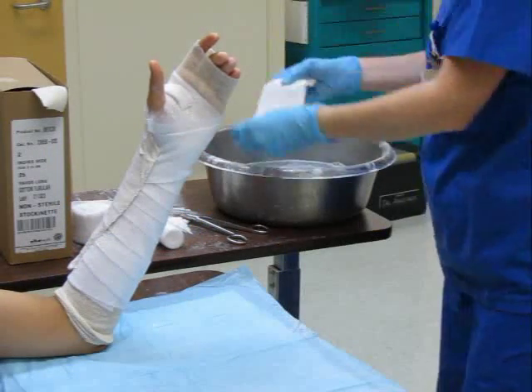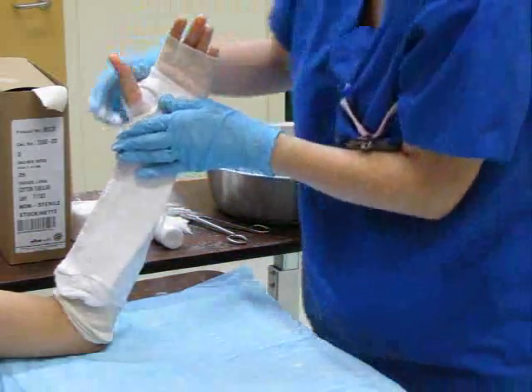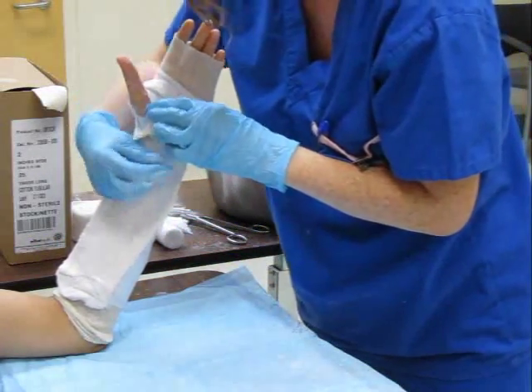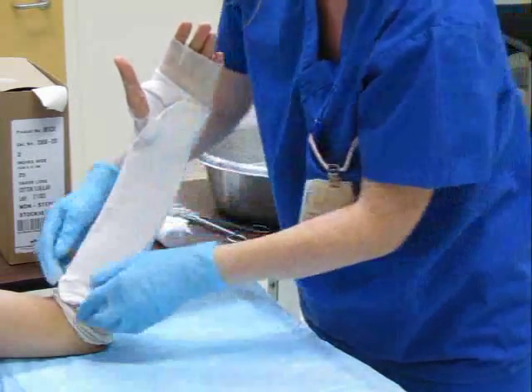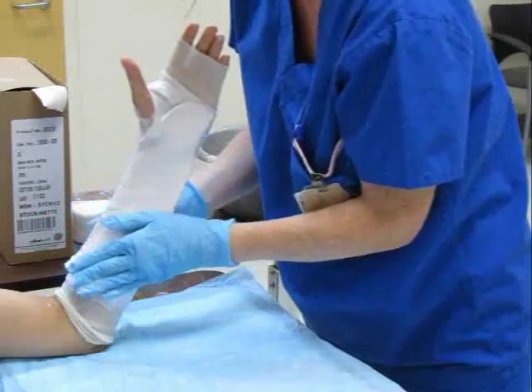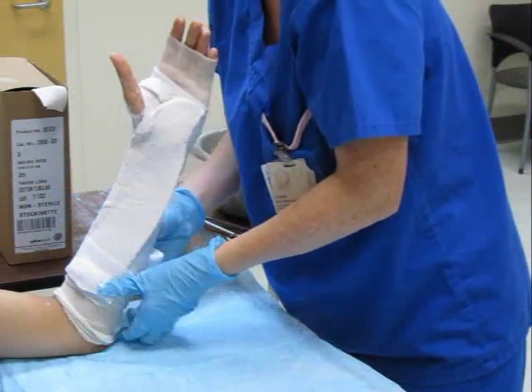Wet the second plaster slab, applying it to the volar surface with the thumb accommodated in the trimmed corner. Overlap the edges of the two plaster slabs to stick together when dry. Ensure that the skin is protected from direct contact with the plaster. Fold over any excess length proximally to ensure the plaster does not overhang the soft roll.